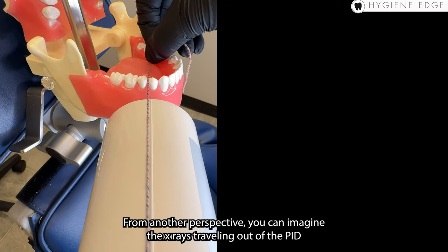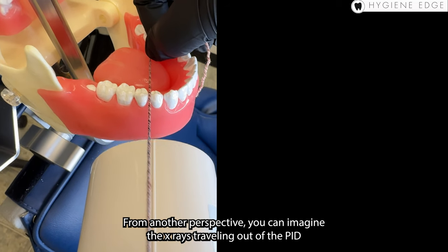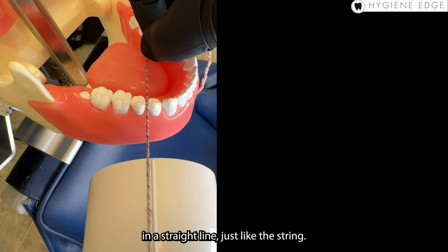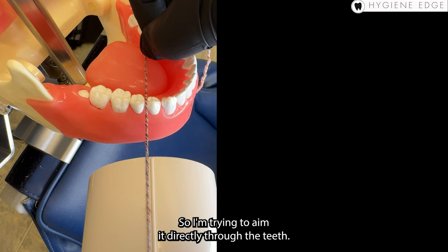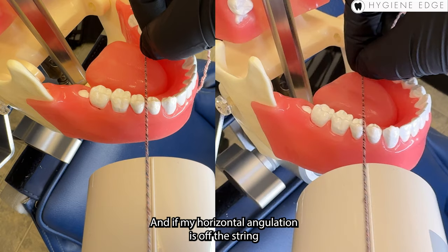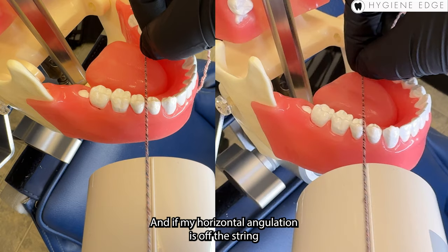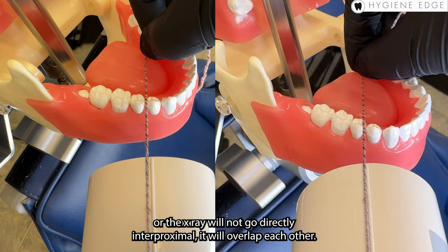From another perspective, you can imagine the x-rays traveling out of the PID in a straight line, just like a string. So I'm trying to aim it directly through the teeth, and if my horizontal angulation is off, the string or x-ray will not go directly interproximal — it will overlap.